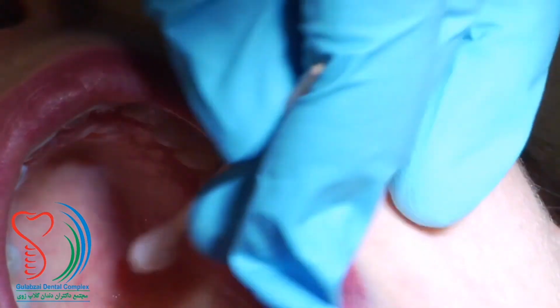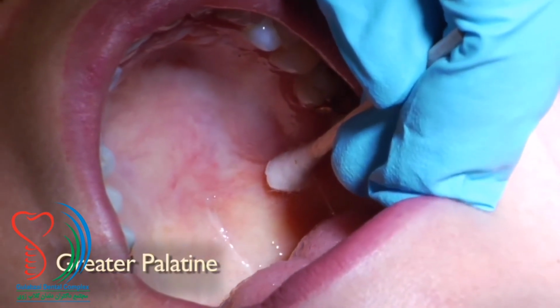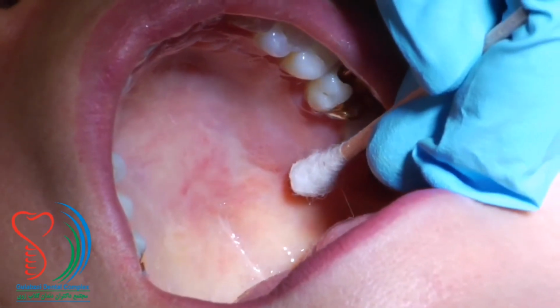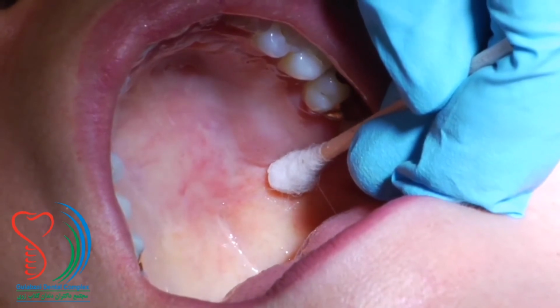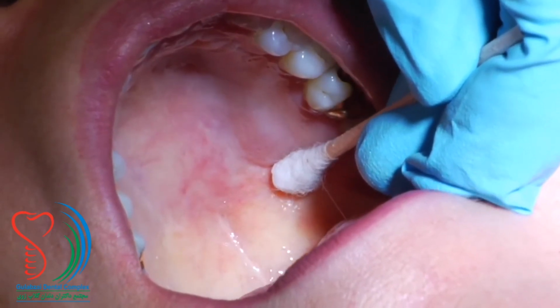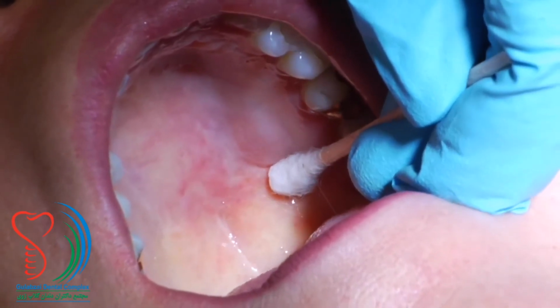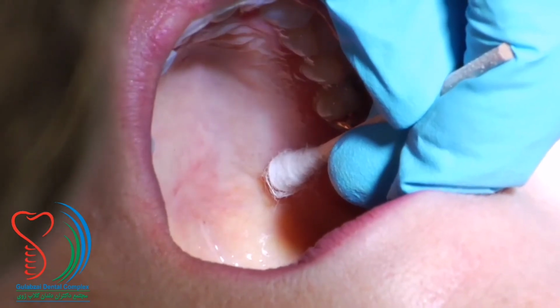The first injection we're demonstrating is the greater palatine. The insertion point for the greater palatine is found by visualizing a line approximately halfway down from the second molar, from the attached gingiva toward the midline. If you palpate there, you'll find a soft, spongy tissue area. Notice the position of the cotton swab.